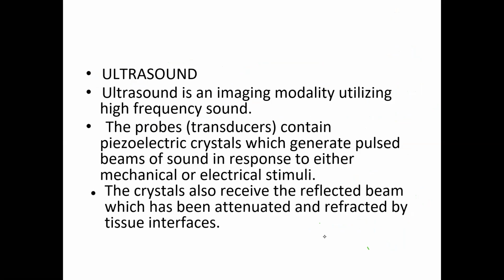Very importantly, you have piezoelectric crystals, which help us in imaging using high frequency sound. The frequency is very high.